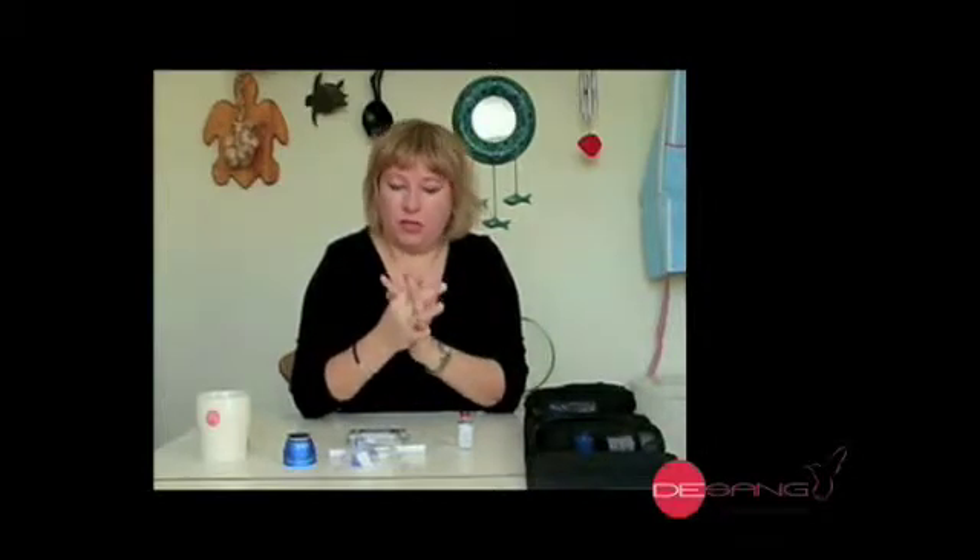Hi, today I need to change my infusion set with my pump, so I'm going to go through that and explain what some of the bits are and show you how it's done.